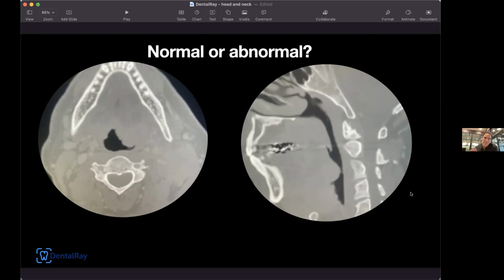Yeah. So this illustrates the utility of multiplanar reformats, viewing things in different planes, in 3 dimensions, to get a better spatial understanding of what's happening. And it also shows you the tip of the iceberg principle, where what we're looking for is a subtle change in what's normally there, what should be there that's gone in this case.